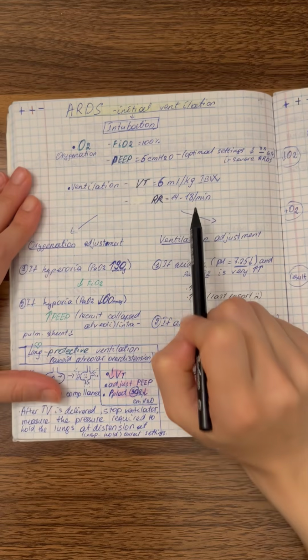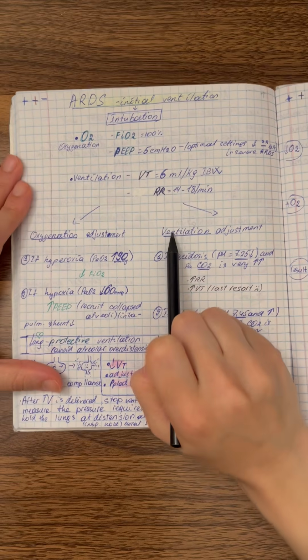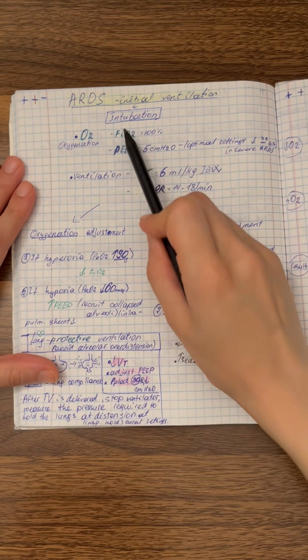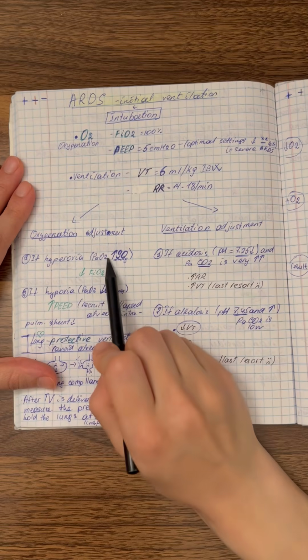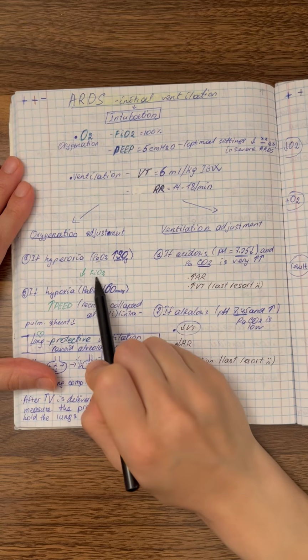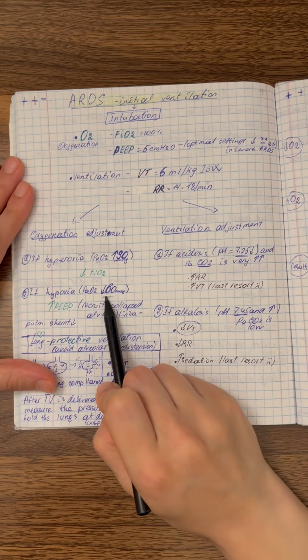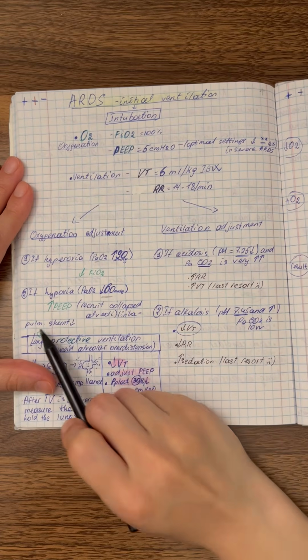And of course, sometimes we need to do some adjustments. We can adjust the oxygenation and we can adjust the ventilation, the parameters that we already talked about. When we need to adjust the oxygenation, we can either change FiO2 or PEEP. When a patient has hyperoxia, when PaO2, which is partial pressure of oxygen, is more than 90 mmHg, decrease the FiO2. If the patient has hypoxia, PaO2 is less than 60 mmHg, increase PEEP. This will recruit collapsed alveoli and will decrease intrapulmonary shunt.